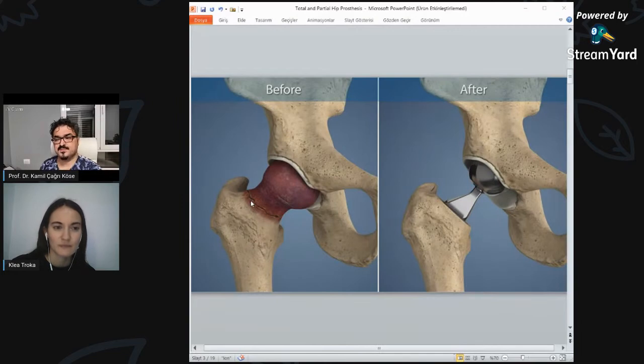And also, when a patient has significant osteoporosis, the structural integrity of the bone can be so compromised that it may not heal, or it can take too long to heal, and that may bring us more complications. To overcome these difficulties, partial hip replacements have been developed.